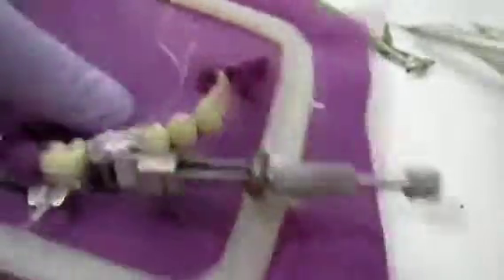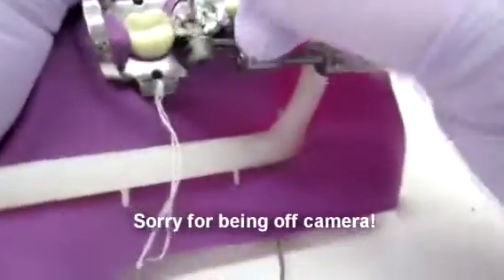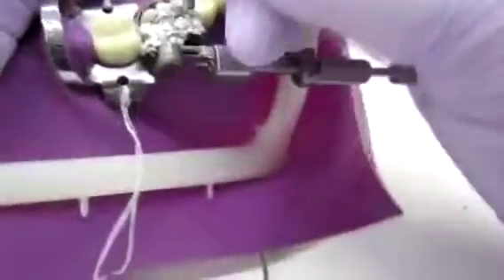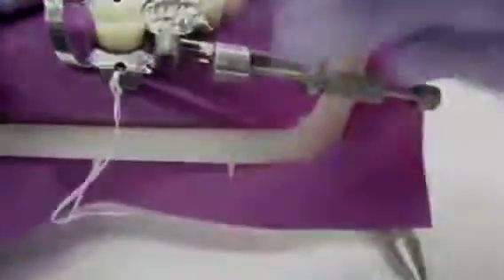I'm overbuilding buccal-lingually and now I'm above where the cusps are, so I'm going to push on the cusps — start on the margin and then on the cusp, that way I have a nice seal. Do you see how fast I'm moving? You need to move fast so that you can have some time to work on the occlusal anatomy. So I'm done condensing.